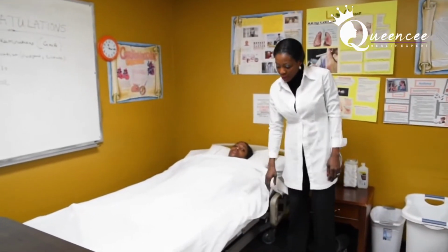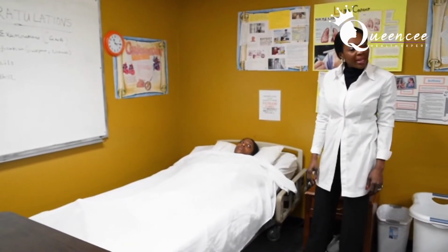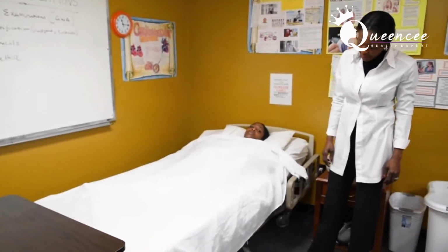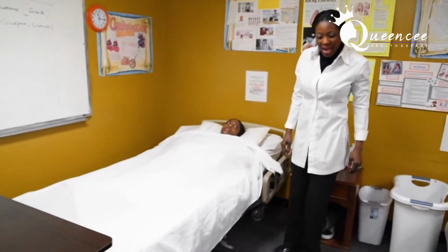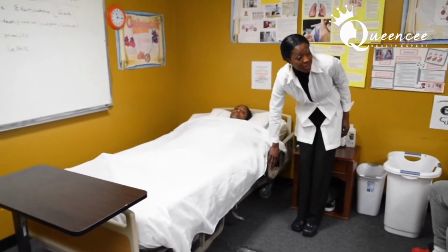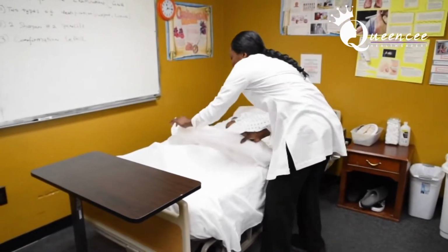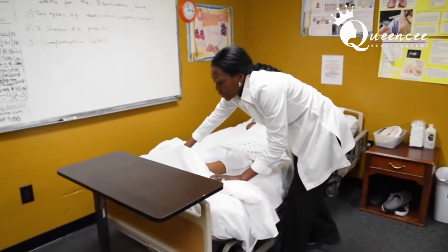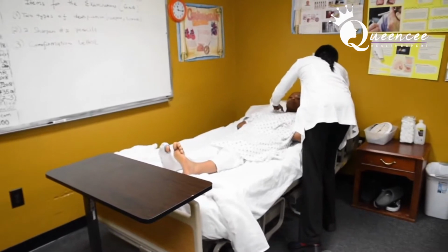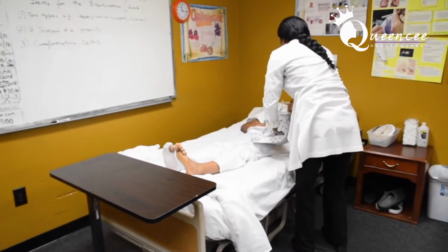Now, when you finish, watch. So I've already told the patient what I'm going to be doing, which is to weigh her. This is what you tell the examiner. I've locked the bed for safety, and my bed is in the lowest position for safety as well. Fan fold your top sheet like we've been doing all along. I'm just going to take the nightgown off. It's not part of the exam, but I just want you to see it clearly.